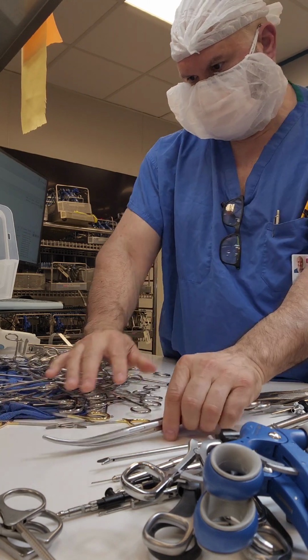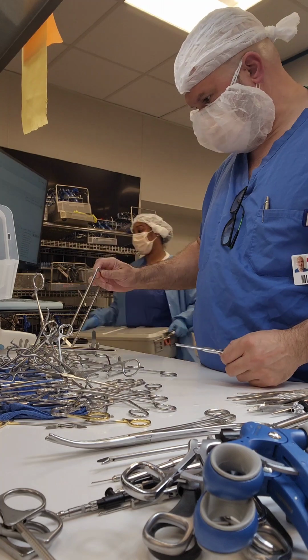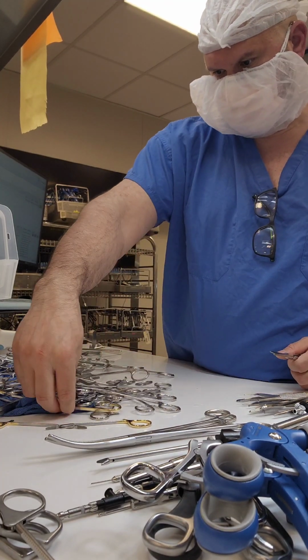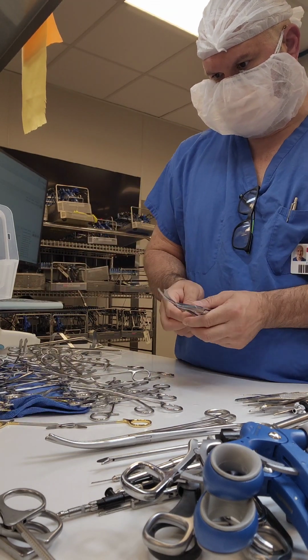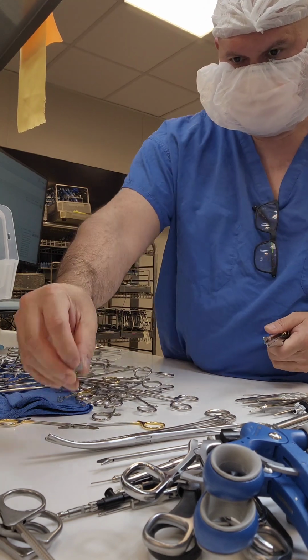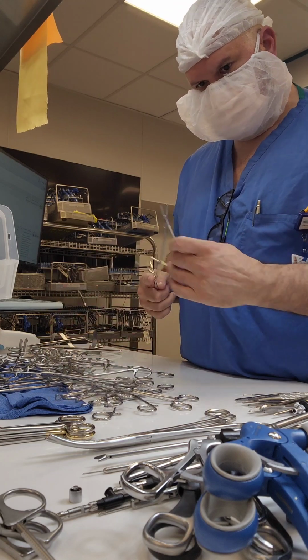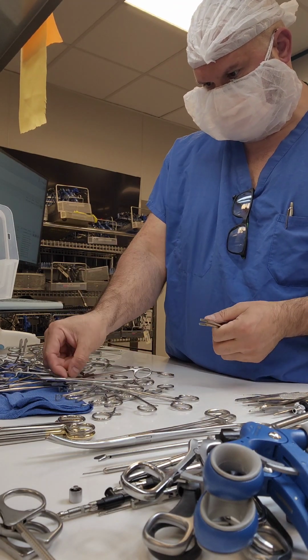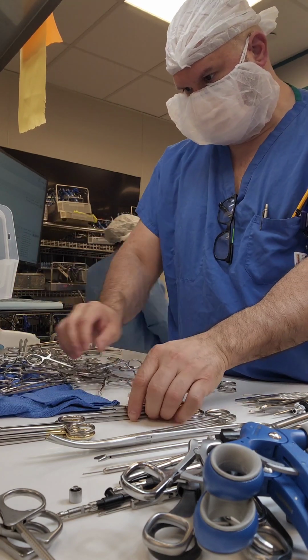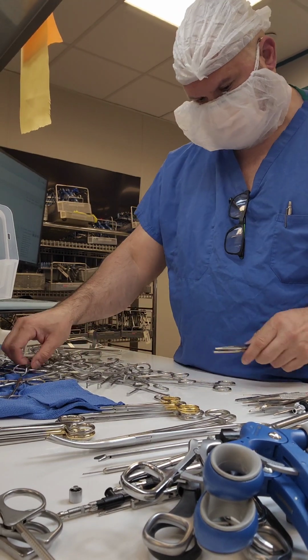So here I am sorting out. So very easily. The reason why I do this is because you actually have an opportunity to touch every instrument every single time, right? It's almost like a two-part inspection. So you'll know if something's wrong with an instrument, if there's some adhesive. You're grabbing these instruments one at a time. You can also grab them in groups. But as you're grabbing them, you have an opportunity to actually visualize the field and say, okay, something is wrong here. Let me put this back in the basket, take it back to decon, and things of that nature.